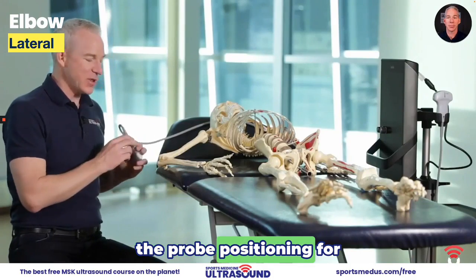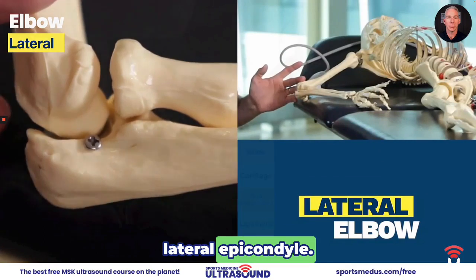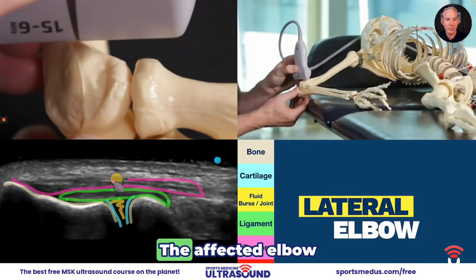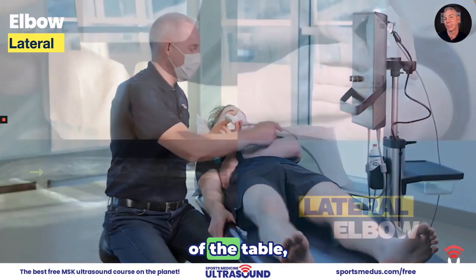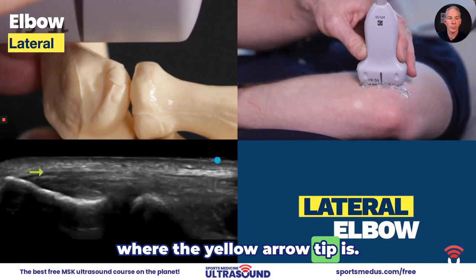I'm going to show you the probe positioning for scanning the lateral elbow. The landmark is going to be the lateral epicondyle. The tendon is the top half. The affected elbow is on the opposite side of the table. The needle would land right where the yellow arrow tip is.